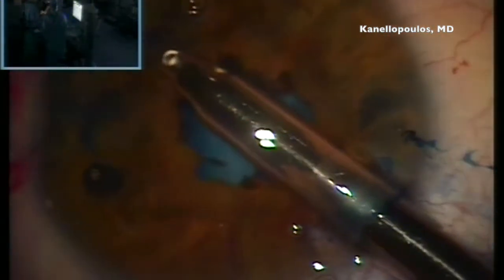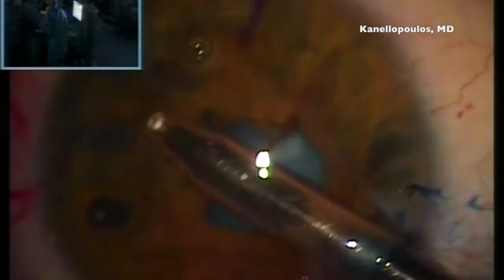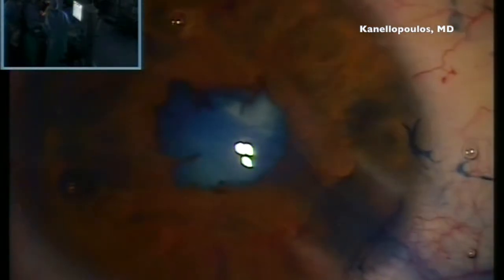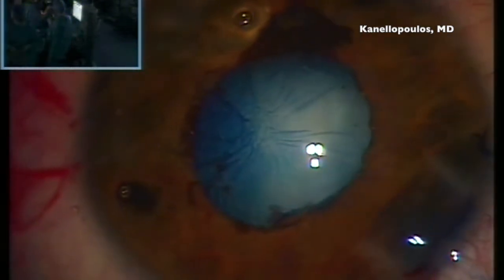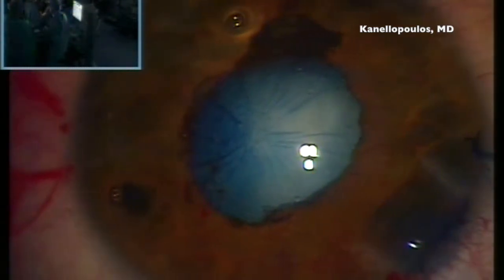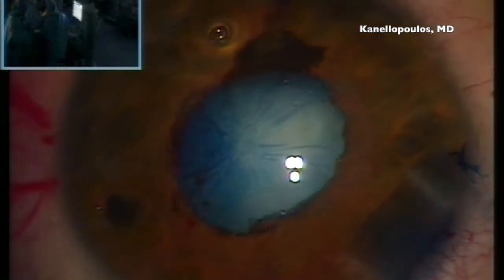We know the blue dye is slightly endothelial toxic, but mission accomplished as far as staining the anterior capsule in this patient very nicely. We can see the blue color, and it also attenuates the folds on the capsule, underlining that this is not just an intumescent cataract, but a cataract that has shrunk in volume. So probably at some point part of the cataractous lens material leaked out from the capsule. He may have gone through some phacoanaphylactic bouts, and we're dilating the pupil here with viscoelastic.